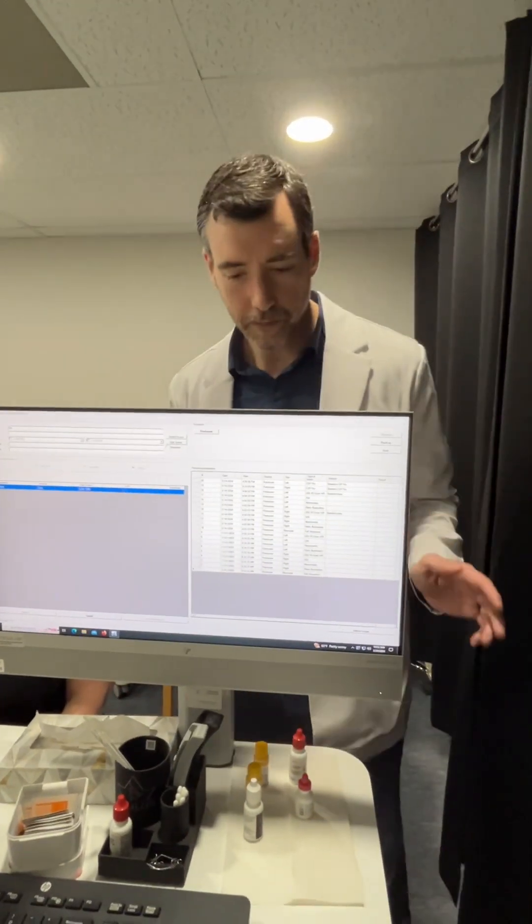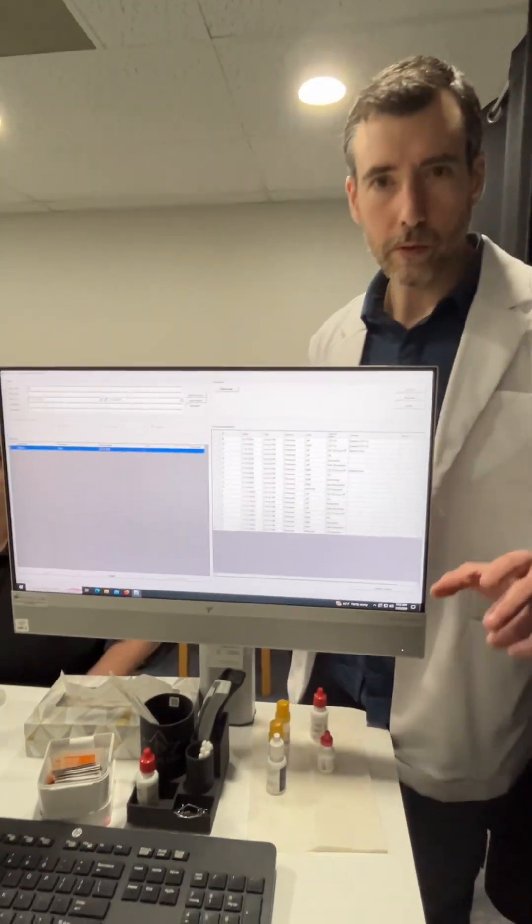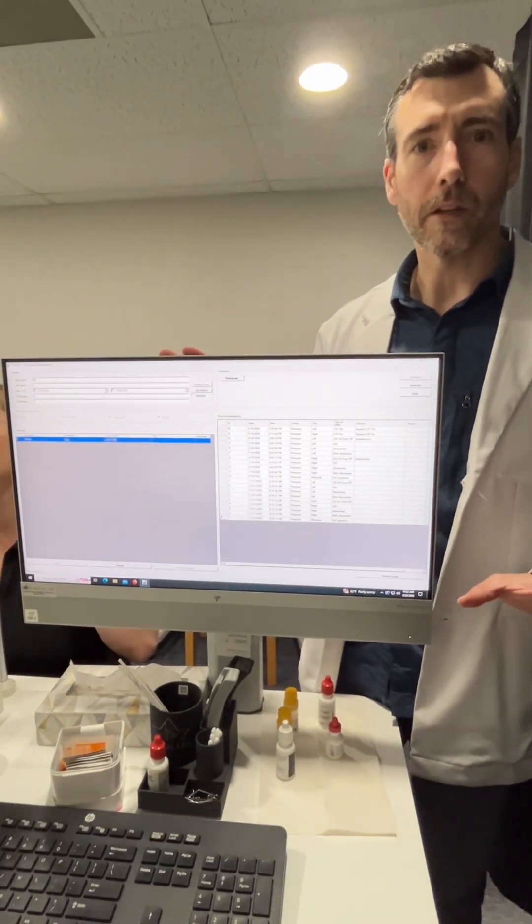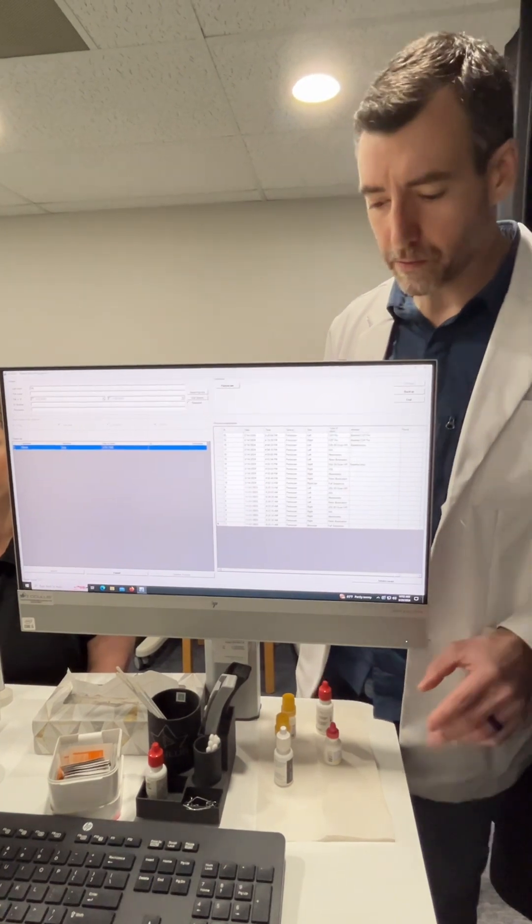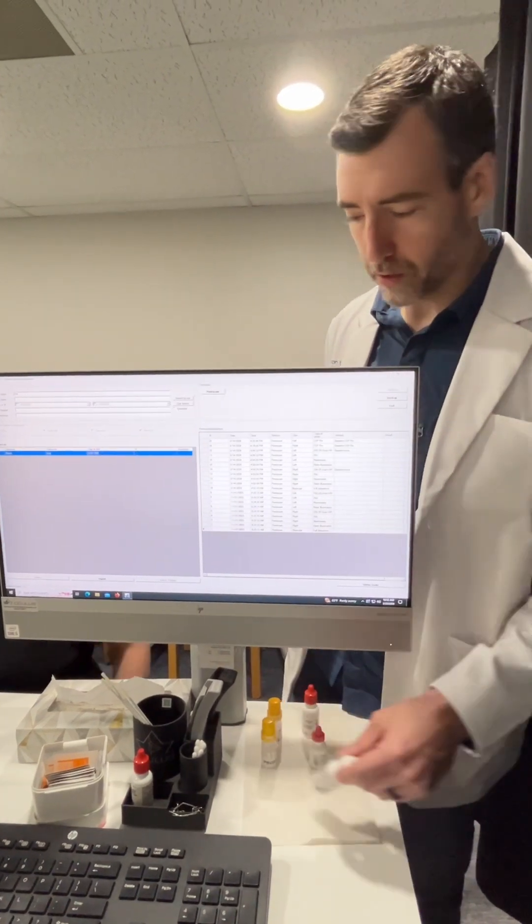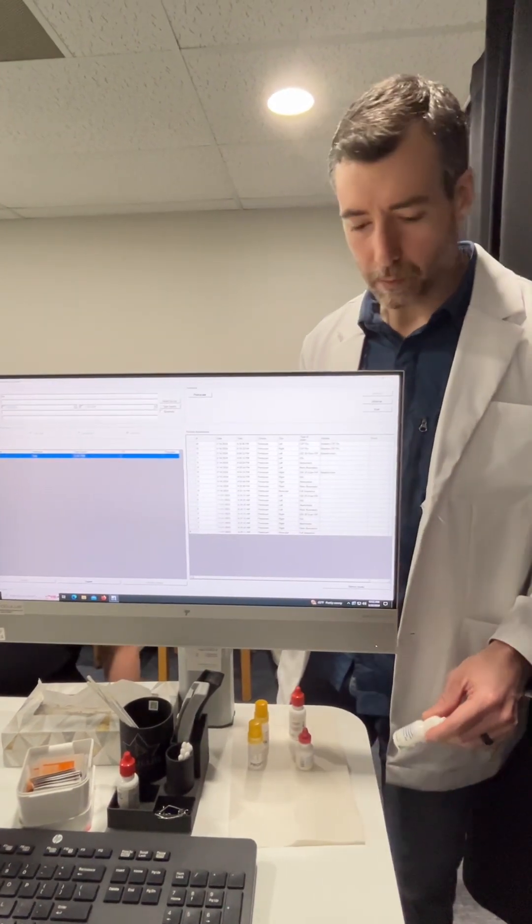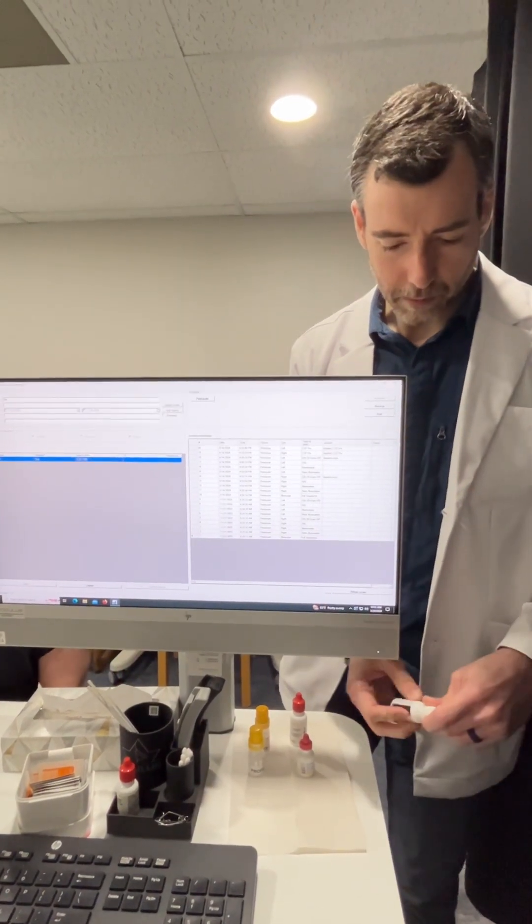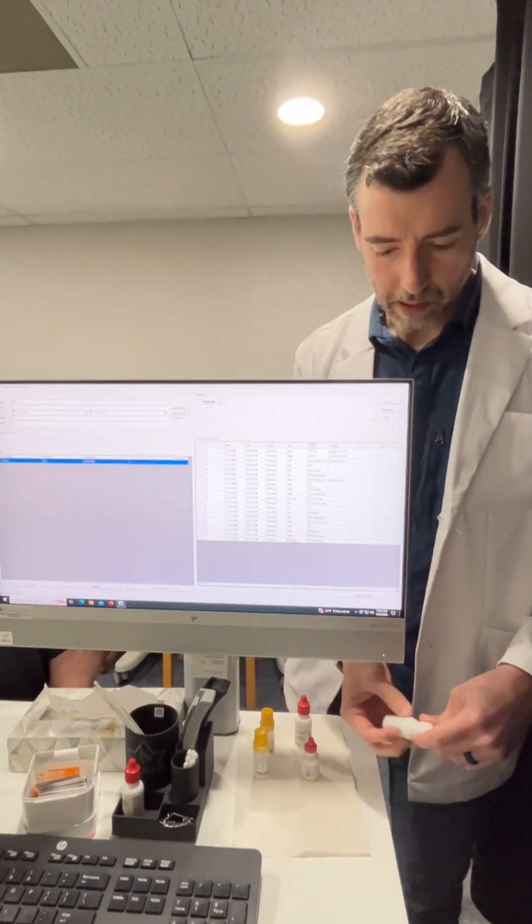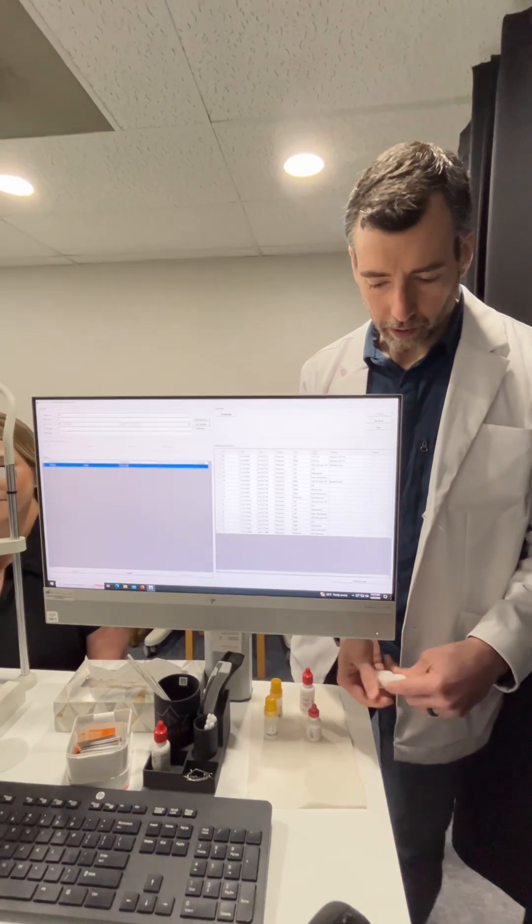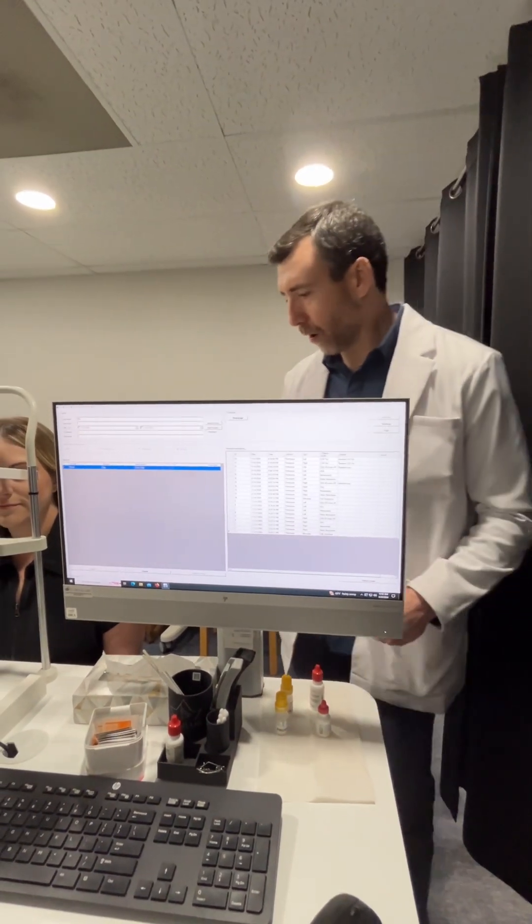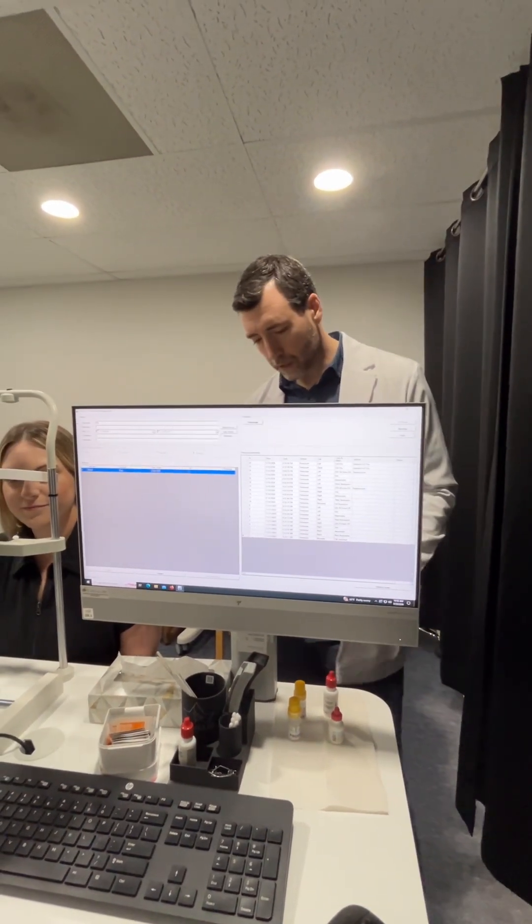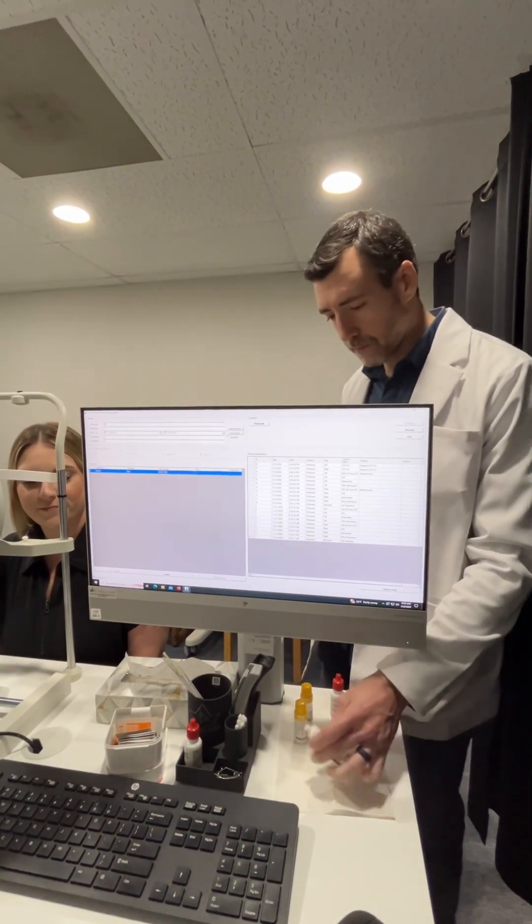Dr. Wolf here. We're going to do some training on the Pentacam AXL wave and Susie, one of my staff members, she's going to be our guinea pig today.